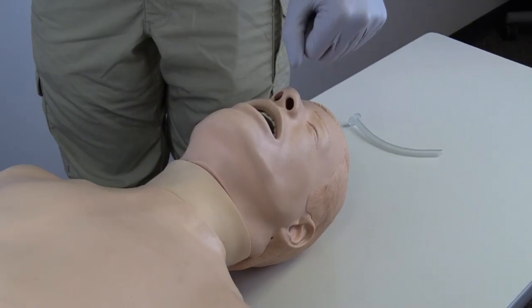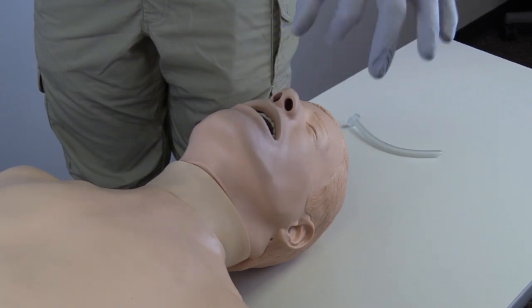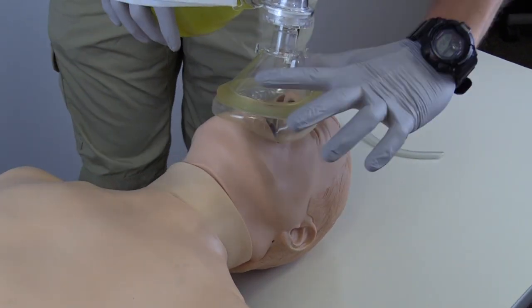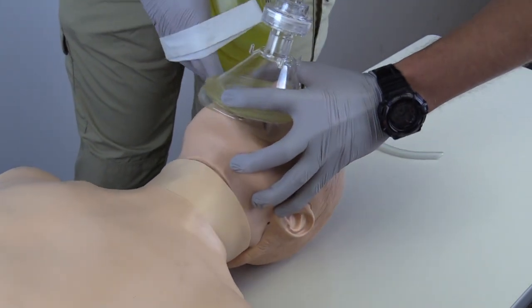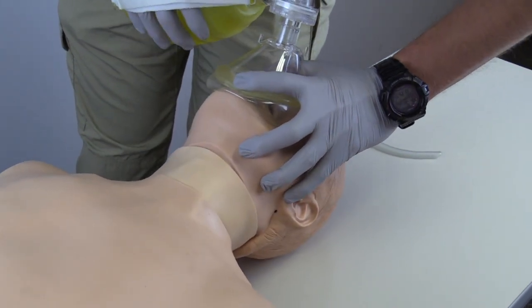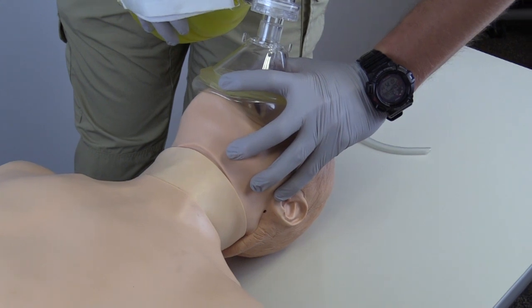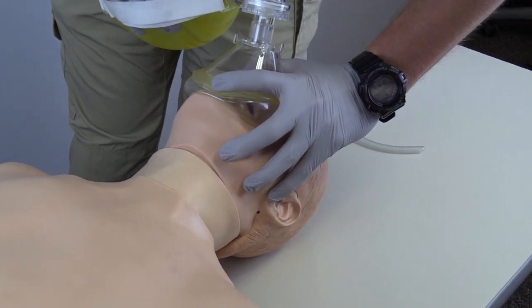Ensuring a tight seal around the mask, I will apply the mask to the patient's face. To do so, I will use the EC clamp technique where my thumb and index finger make a C to hold the mask to the patient's face, and my remaining fingers make an E to bring the patient's face into the airway.